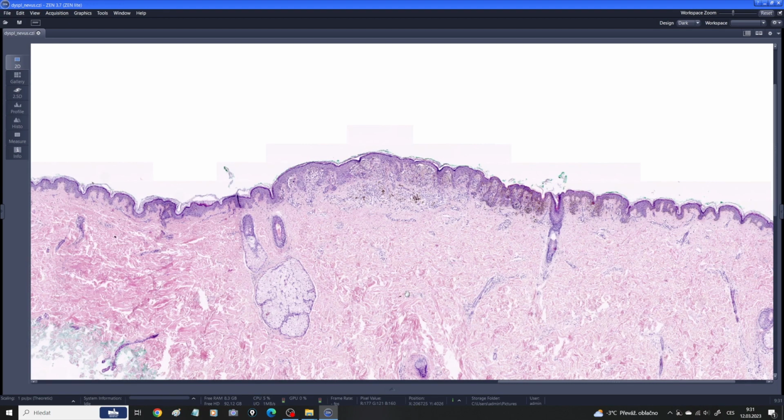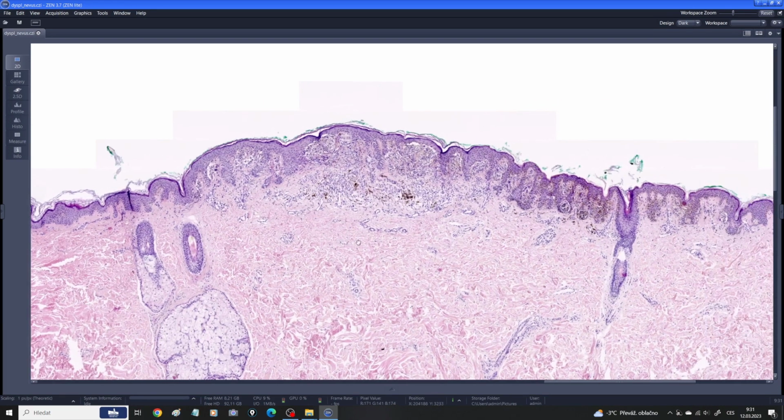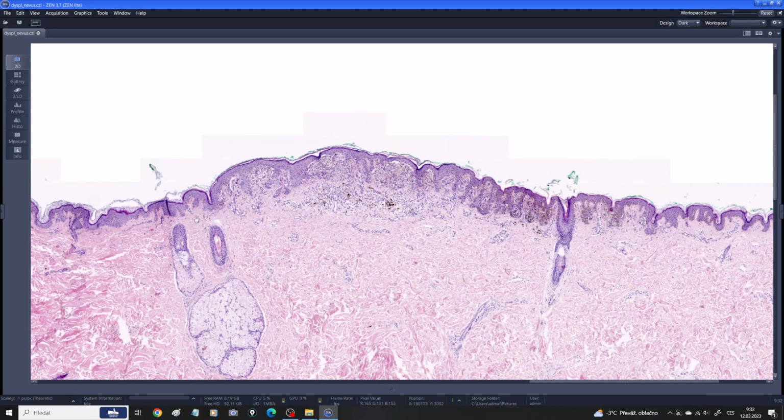The lesion looks worrisome on both microscopical and macroscopical level. So even grossly, the lesion is usually larger compared to other types of nevus. It is slightly irregular. So sometimes there is some degree of clinical suspicion for that. And even histologically, you can see that the lesion is quite atypical. That's why we call it dysplastic nevus, because there is some degree of dysplasia. And you can see atypia on both architectonical and cytological level. Still, the lesion is quite symmetric. So if you look at the lower magnification, the lesion is still quite symmetric.